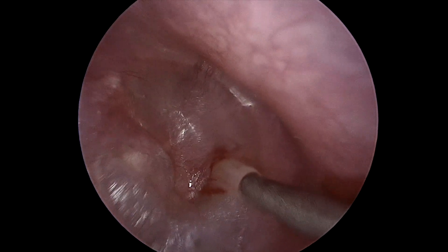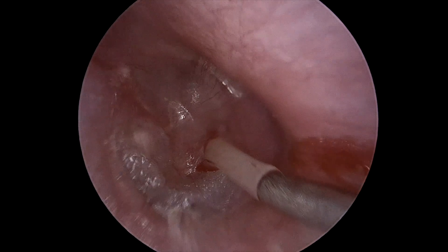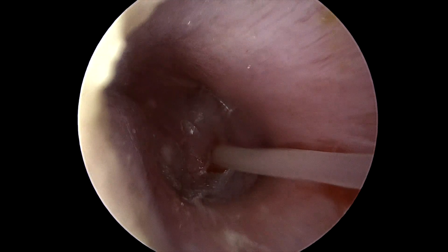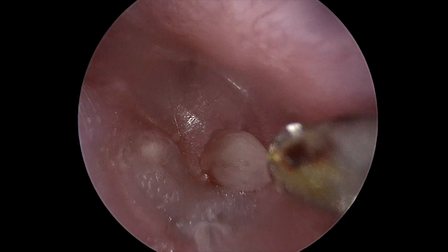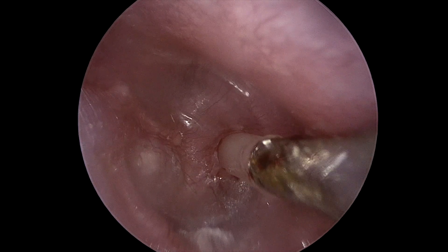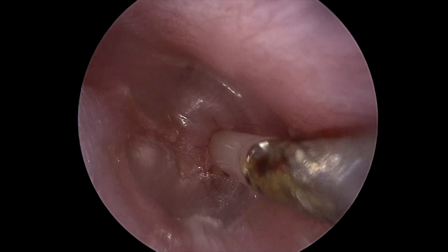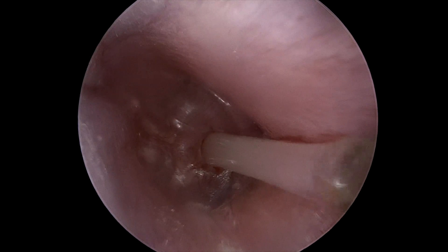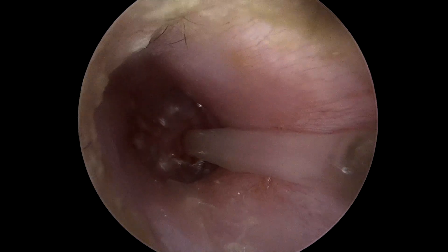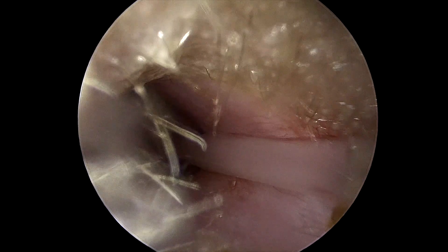A suction is used to remove what turns out to be an impressively tenacious mucoid effusion.